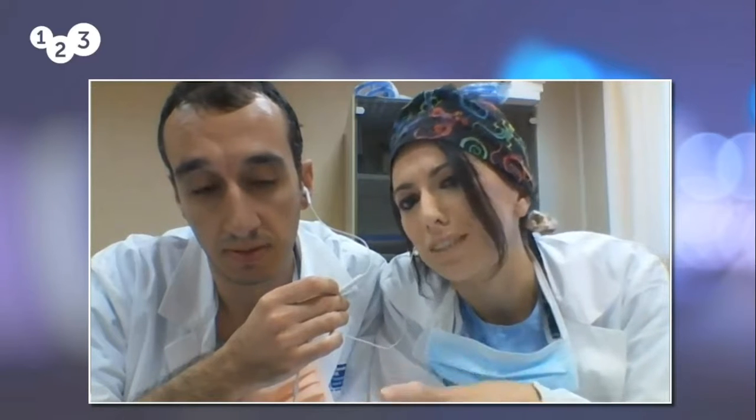Every time we do something on the lung, we turn off the ventilator because the spread is so high in this moment. And also when we do the bronchoscopy, we use a filter between the ventilator and the bronchoscope and the tube.